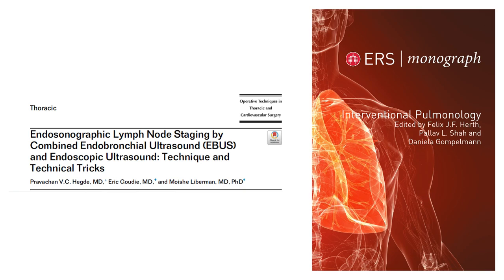Gotcha. And then you said you're using mainly needles. I would assume that most of these cases you would not be doing cryoprobe. We in the bronchoscopy field have become pretty enamored with the cryoprobe. I'm assuming you're not using cryoprobe routinely. Cryoprobe through the esophagus, absolutely not. It could be dangerous, and we never do cryobiopsy through the esophagus. Cryobiopsy, always we go transbronchial.